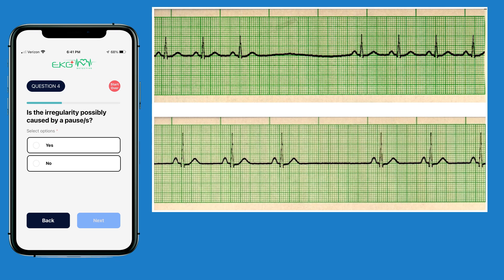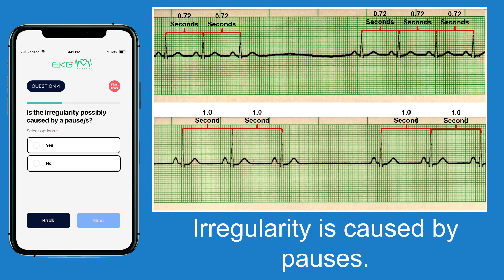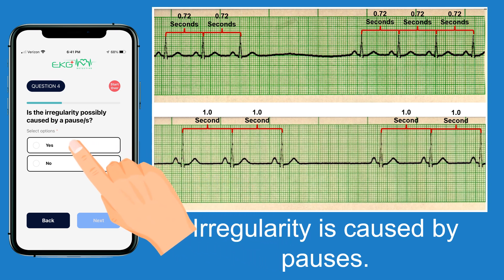Now that we've reviewed the criteria for pauses, looking at the first ECG we have an R to R interval of about 0.72 seconds, and measuring across the other R to R intervals they also measure 0.72 seconds — so we do have a pause. The second ECG has an R to R interval of about one second, and when we compare that to the measurable R to R intervals they are also one second. So both ECGs have pauses. We go to the app, select yes, and hit next.